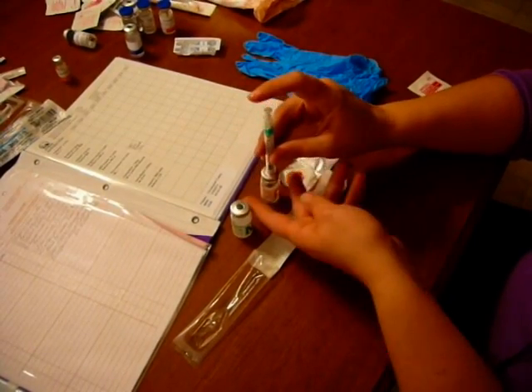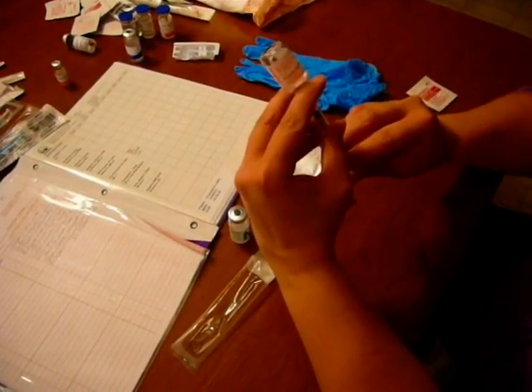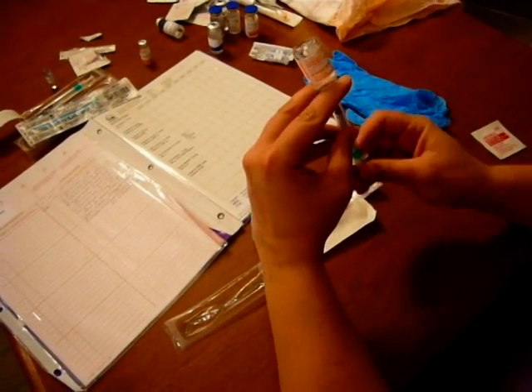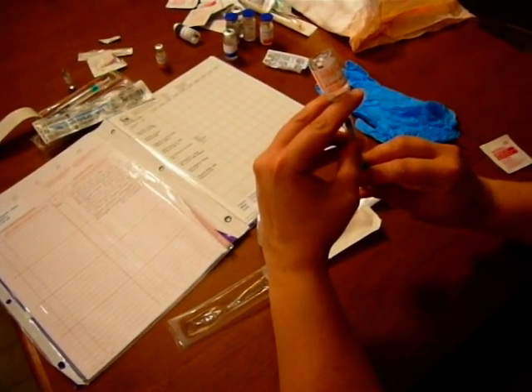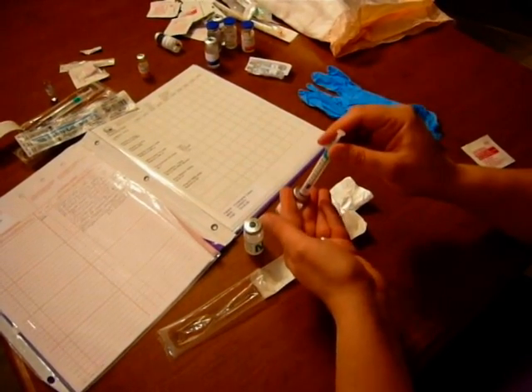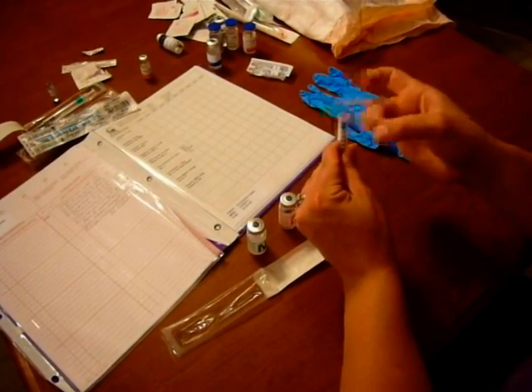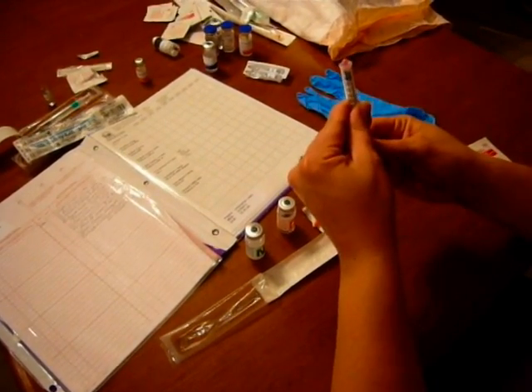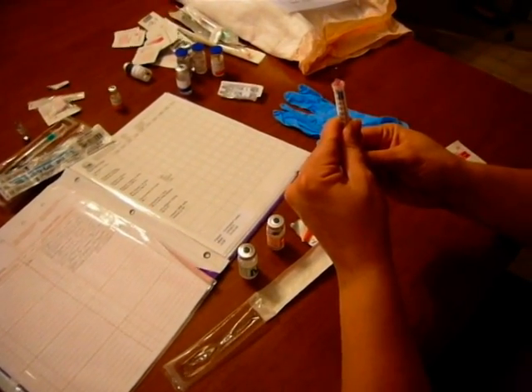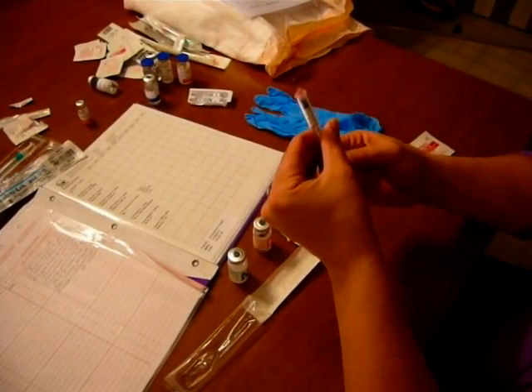Then I immediately flip and draw up my 6 units of regular. The important thing here is that I need to get all the air bubbles out and make sure it's exact before I go to the NPH insulin, because if I don't, I won't know what I have in my syringe if I need to make corrections. Because this needle is so fine, I drop just a little bit of extra, tap all air bubbles to the top, and clear them out, making sure I have exactly 6 units with no air bubbles.